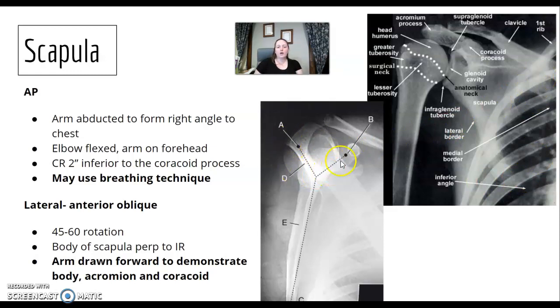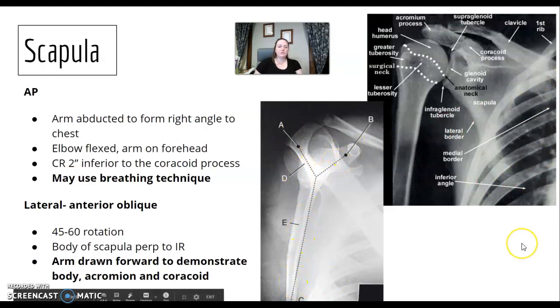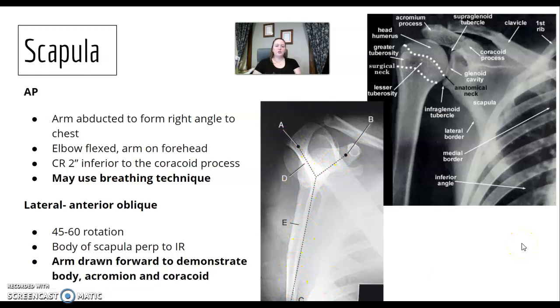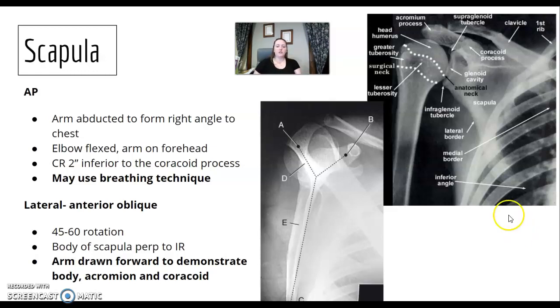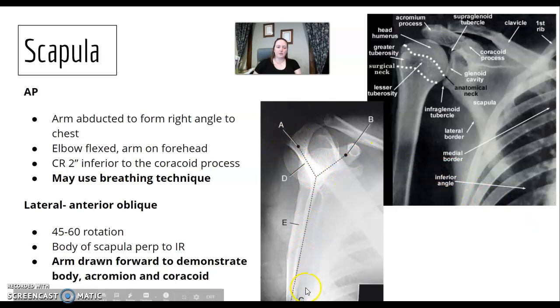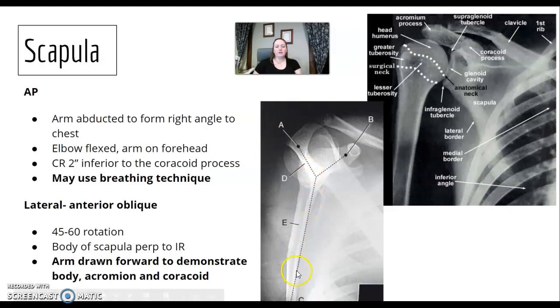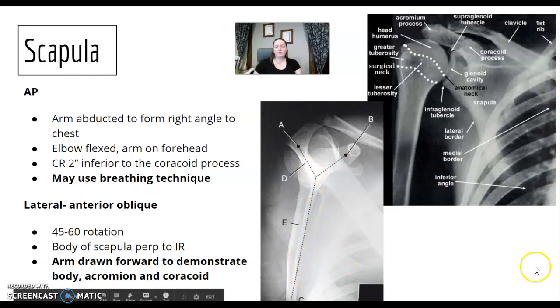The lateral scapula is your Y-view shoulder position. The variation is that you bring the humerus away — the patient reaches to the other side of the body, drawing that arm away. You want to see the acromion and coracoid forming a nice Y picture, giving you a lateral view of the scapula.